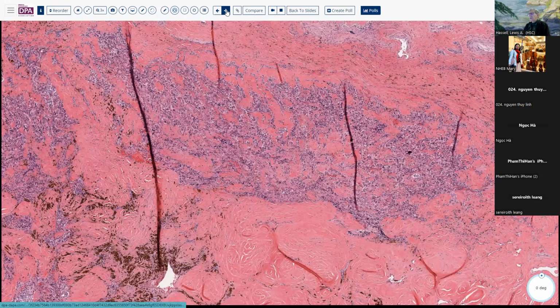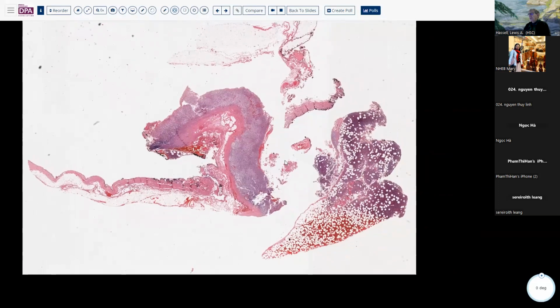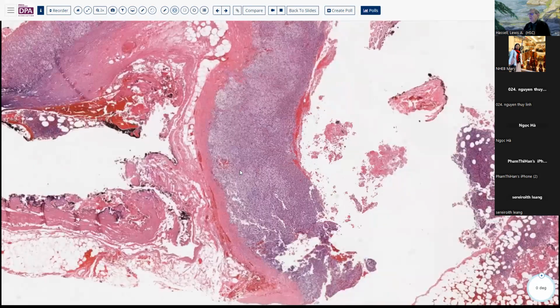So we've got a few more minutes. I thought I'd just put one up here; this is not really an endocrine lesion, but it is in the adrenal. And usually this is a lesion that the radiologists can identify on CT scan and it won't get resected. So this is sort of an old case of an adrenal.